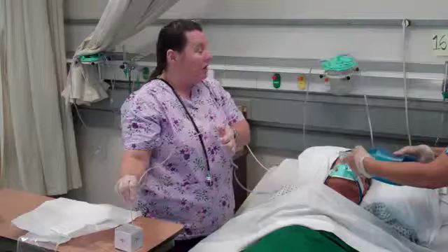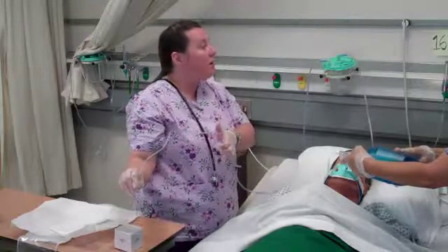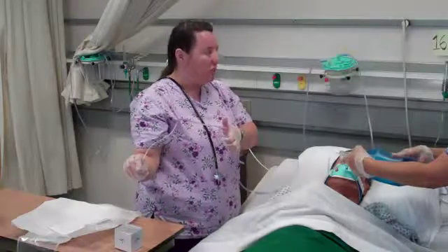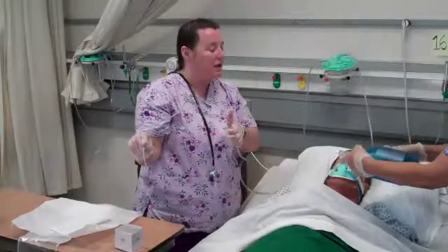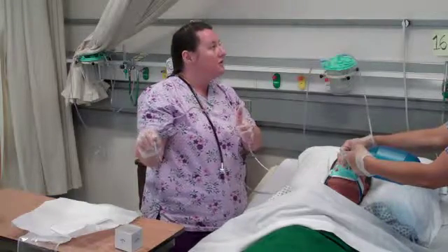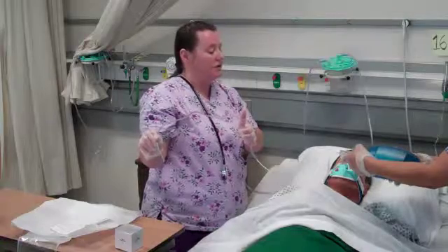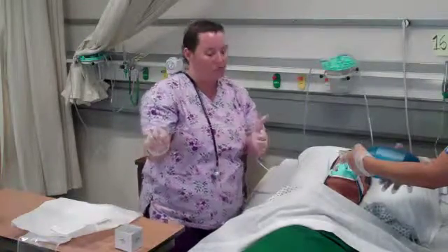I'm going to check my monitor here to see if the oxygen saturation has come up. If the heart rate has increased at all with that procedure, which is a normal finding, that it's come down to its baseline and that no arrhythmias are present. If I have stimulated any type of arrhythmia, I would want to stop the procedure and get the patient to baseline. My oxygen saturation has come up a little bit. It's not at his normal saturation yet. His condition appears like it would warrant a second pass.